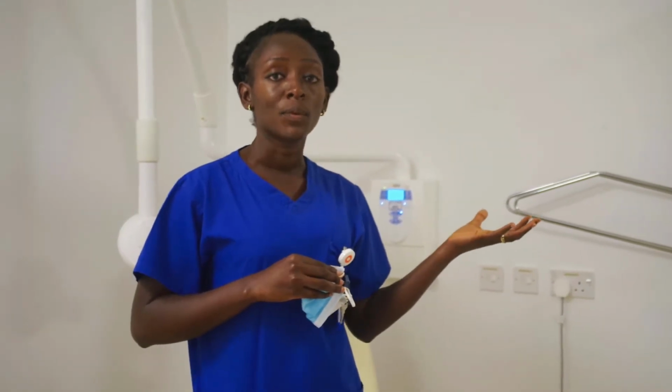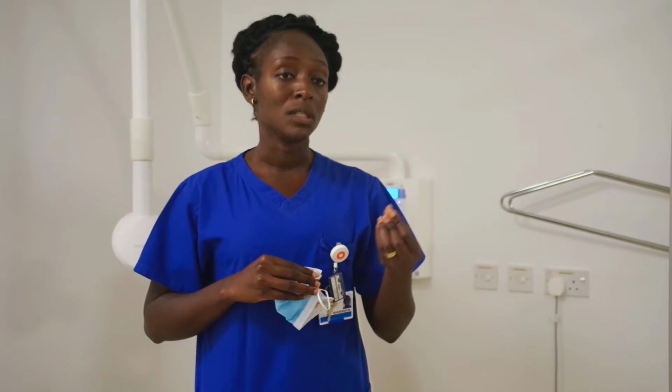And Sarah mentioned that it has to be as close as possible, and she mentioned the inverse square law and the effect it would have if the X-ray tube is further away. You'd also have to select the right exposure to be able to get the best quality image. And remembering that the teeth have various densities, so the exposure that you'd use for your canine, for instance, would be completely different from what you'd use for your molars.